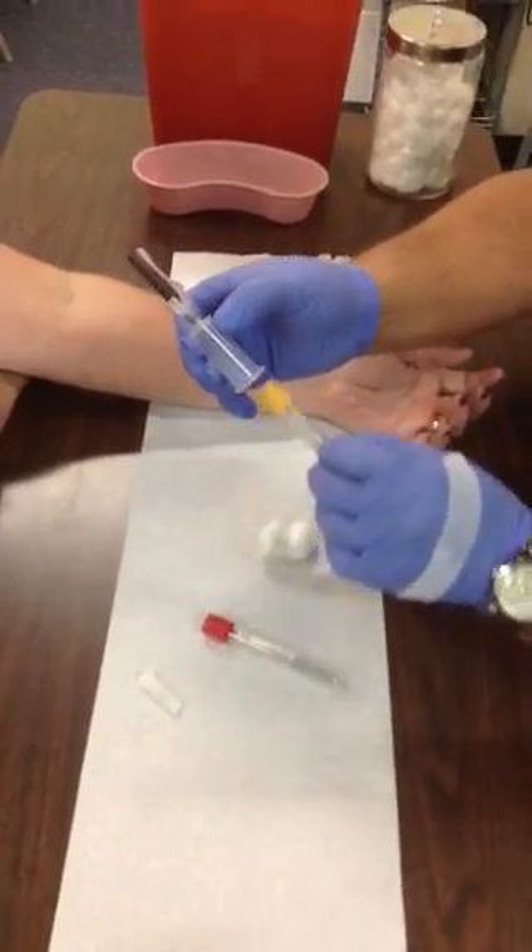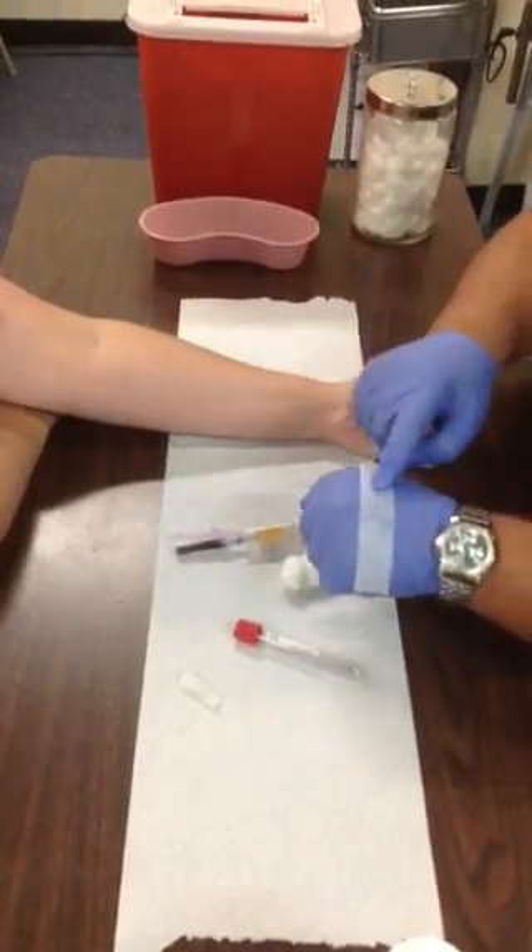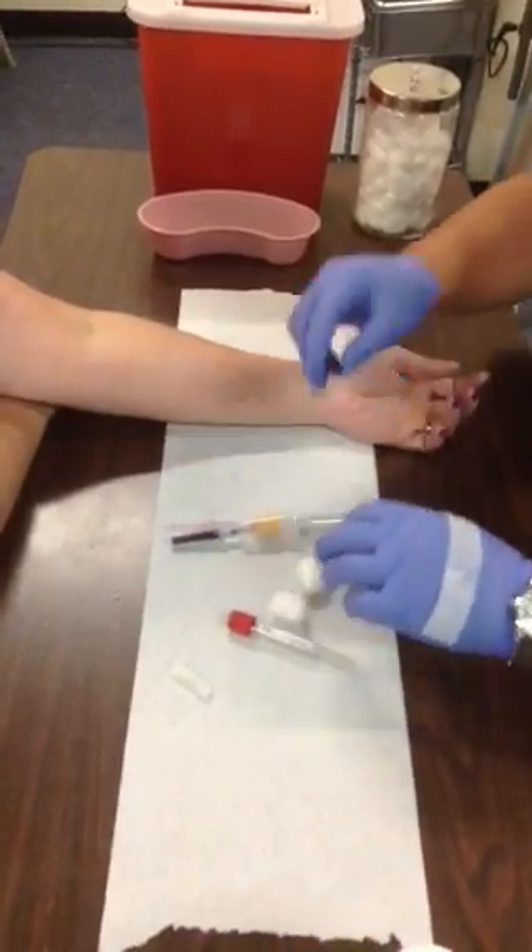Take your first tube, place it in the back end — don't push it all the way through — and that's actually ready to go. Have your tape and cotton ball ready as well.